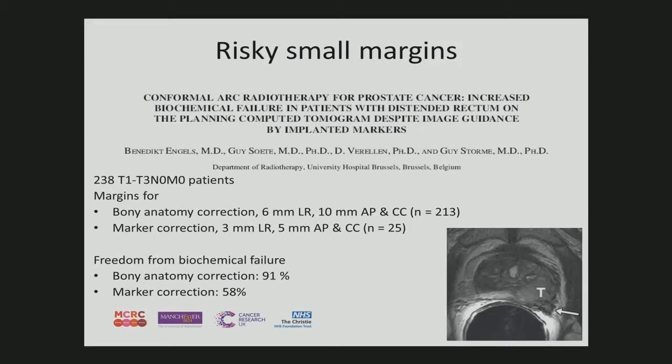You have to know about the biology, and if you look at a prostate cancer MR scan, very often you can see actually that there's a dominant lesion. This is the prostate. The dominant lesion, tumor grows out of it. Tumor, crab, things grow out of it, and they grow out of the prostate in the surrounding tissue, typically by 1 millimeter or 4. If you have a centimeter margin around because of the uncertainties, that's negligible. But if you shrink those margins to 3 millimeters, then all of a sudden you're going to miss a lot of patients. So it basically means that from physical accuracy, we have to start thinking about the biology.